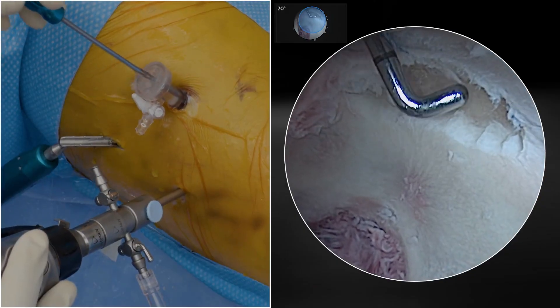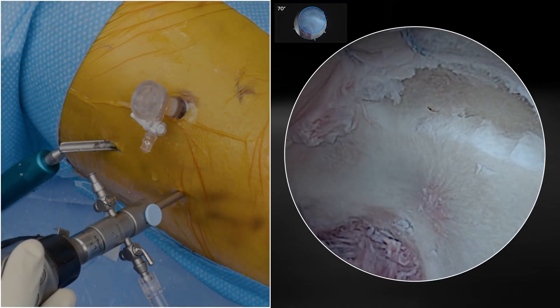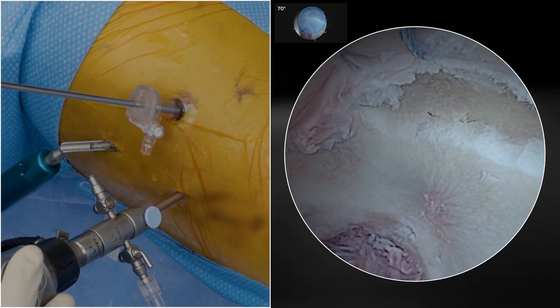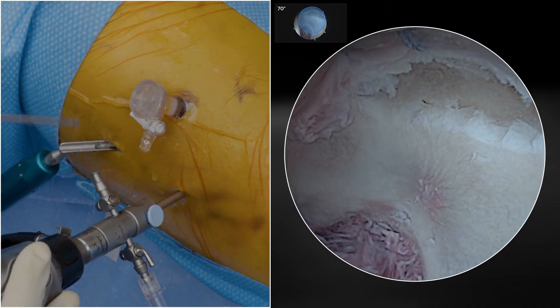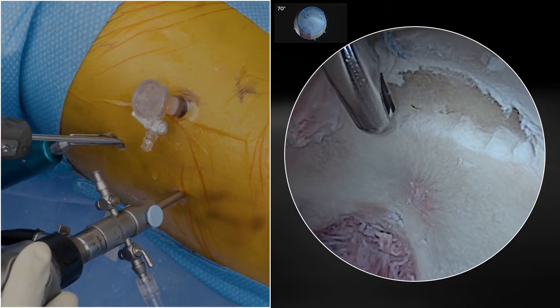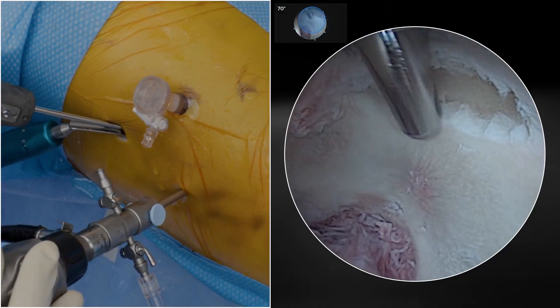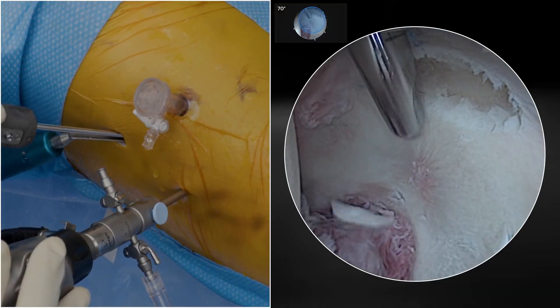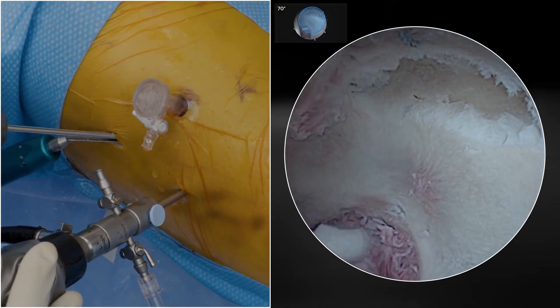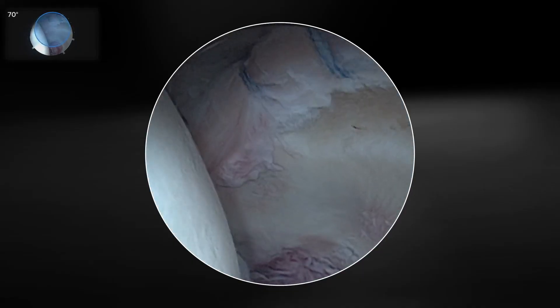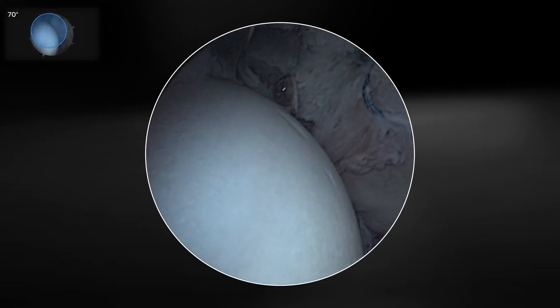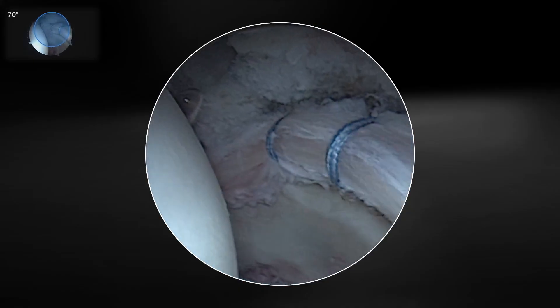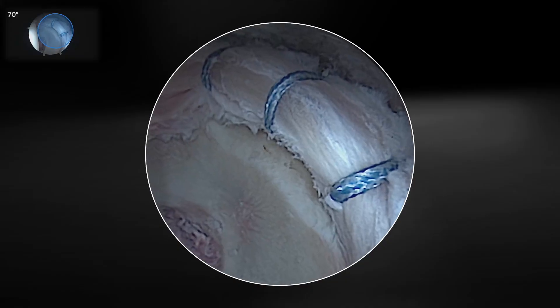Where can we obtain the potential graft for AutoCart? The cam delamination flap itself could be a source. You can introduce your shaver, and depending on the version of the acetabulum, you might find the angle of approach to that cam delamination to be easier either from your mid-anterior portal or approached more perpendicular from a distal anterolateral portal. Sometimes the cam delamination lesion itself may provide sufficient tissue. But one of the most robust sources of cartilage in the setting of FAI is in fact the cam lesion itself, as the cartilage covering the cam lesion extends well distal to the physeal scar.